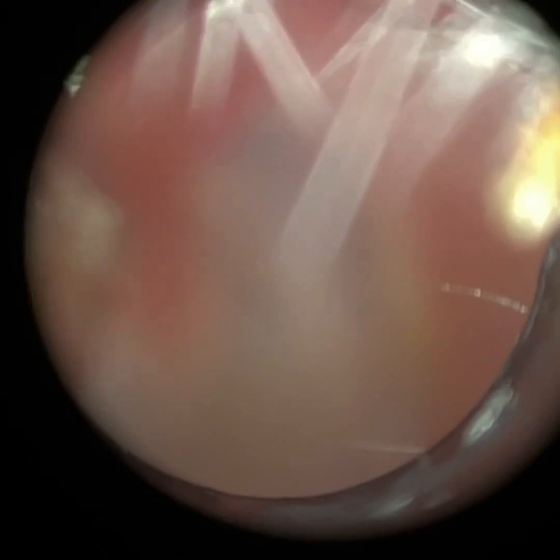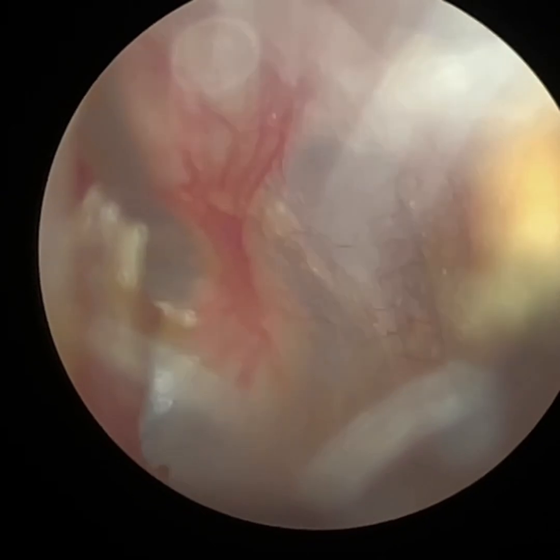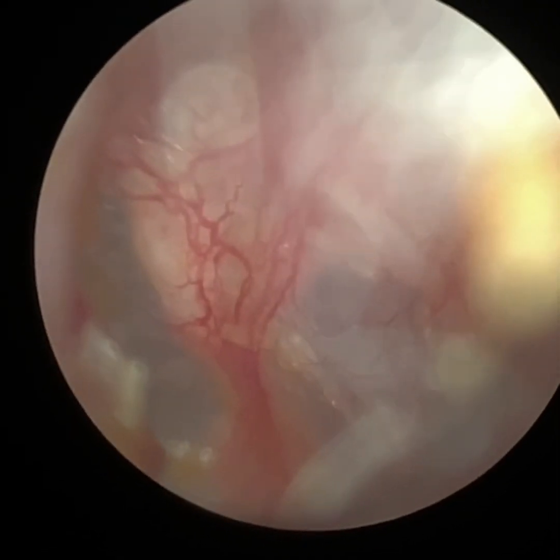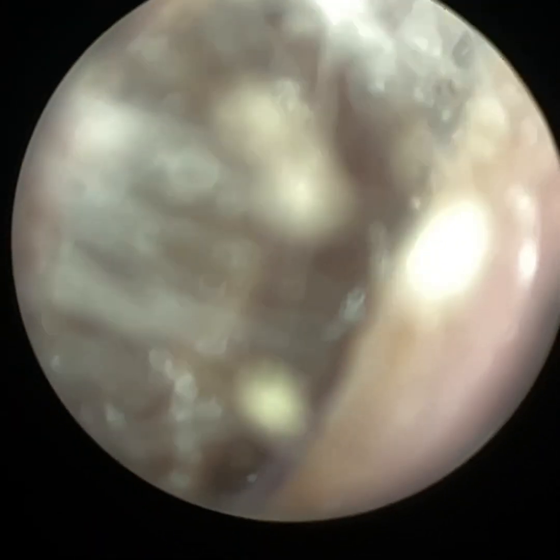We call that an isthmus, which is a narrowing. And to the left, those hairs are actually from the tragus — the tragus is the piece of triangular cartilage just in front of the entrance of the ear canal. To the left there's a bit of a blister there, so this plug was really adhered, which is probably why it was quite difficult to remove. But that will soon settle. There's some vascularisation of the blood vessels of the eardrum, but otherwise that ear looks really good.